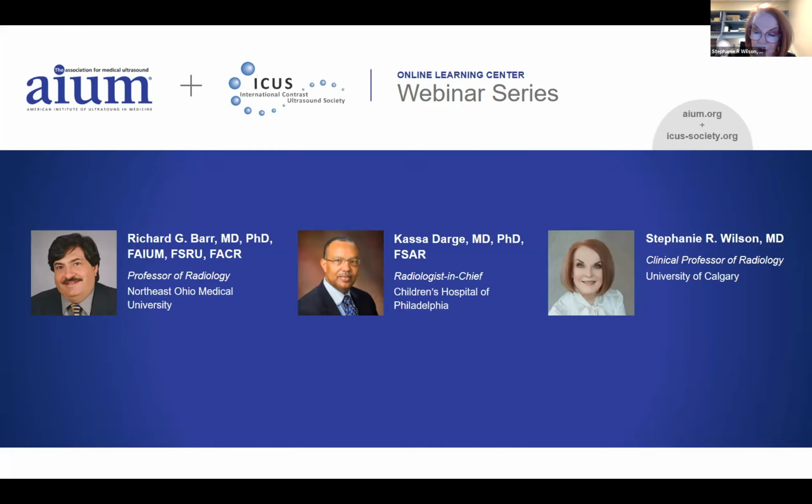And actually, Richard, I'm sure that you and Kassa would both agree with me about this because you two join me in this role. I think that for CEUS to be successful in an institution, it's important that someone on the physician side champions what we're doing. I don't think an ultrasound department will grow on its own with sonographers doing CEUS unless someone champions it to get the clinicians interested, to get the support of everyone so that that can be a successful venture. But no, you're absolutely right. There's no reason why it can't be in any environment in which we place it. That's a great comment. Thank you for that.